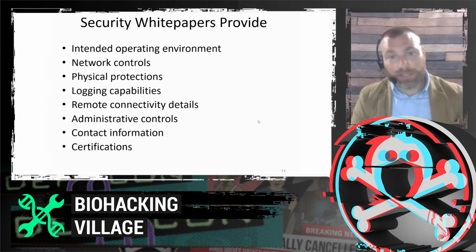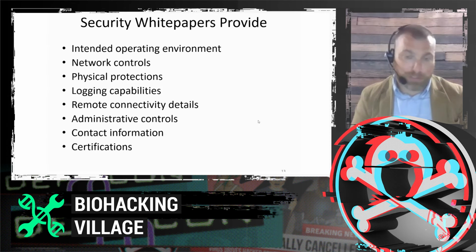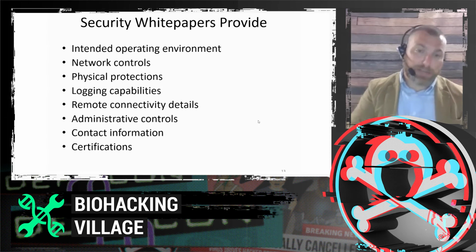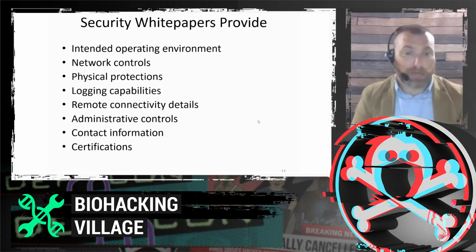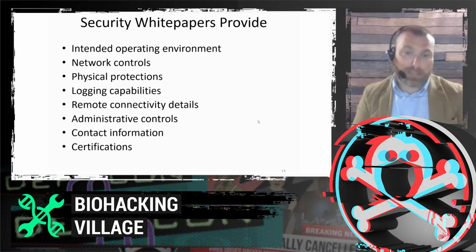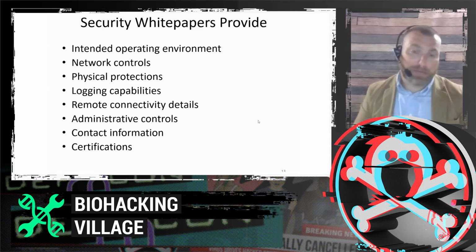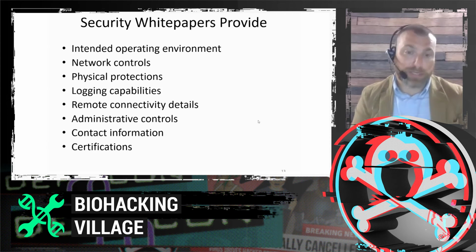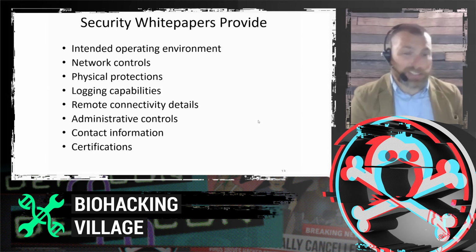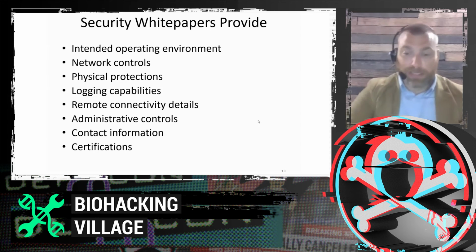should secure this device. And network controls, physical controls, logging, how the manufacturer may remotely connect to the device for service, and whether you want that or not. You can turn it on or off, likely. Any administrative controls, how to contact both service, and then maybe for a cybersecurity issue, how to look for that too. And if the device has any certifications like ISO 27001, things like that.